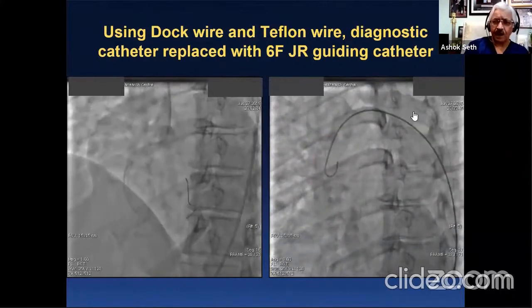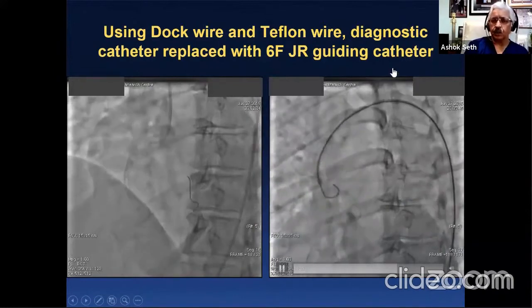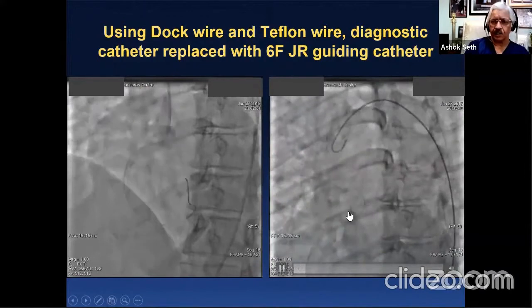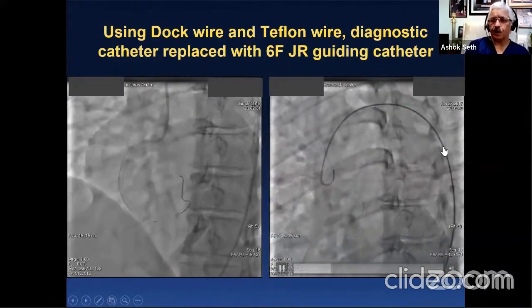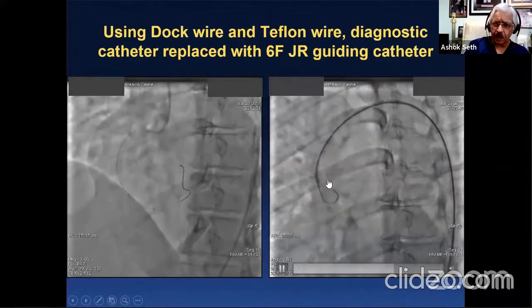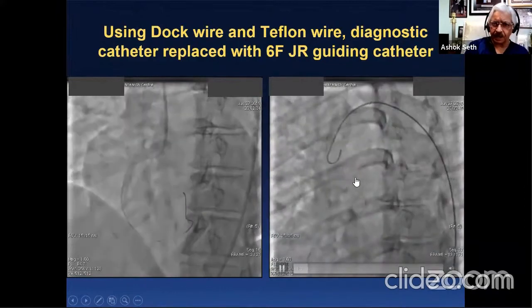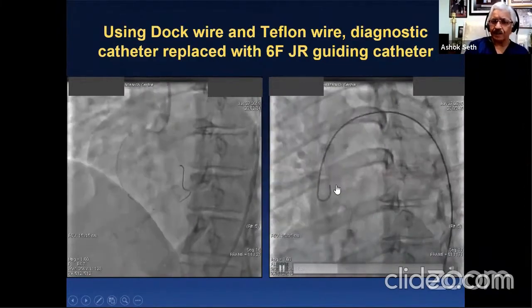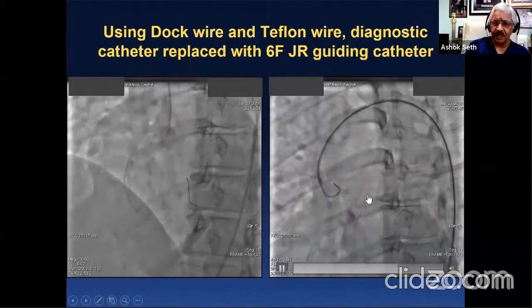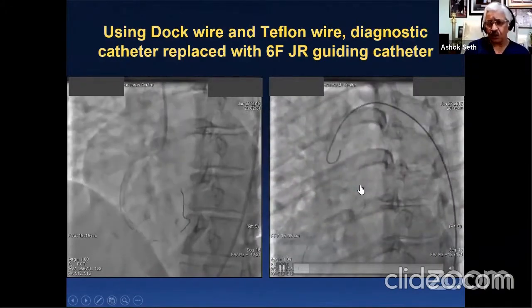So the 035 wire has to come close and down the ascending aorta, so that you can get your guide to just above the ostia of the RCA. Now there, you then remove your 035 wire, and now you're just sitting alone on the 014 wire. But what I hope you can see, that curve, which is a redundant curve, it actually comes like this. Because if you don't have the redundant curve, your guide is going to be facing the opposite side until you clockwise turn it towards the right coronary ostia, and again is going to pull everything out.